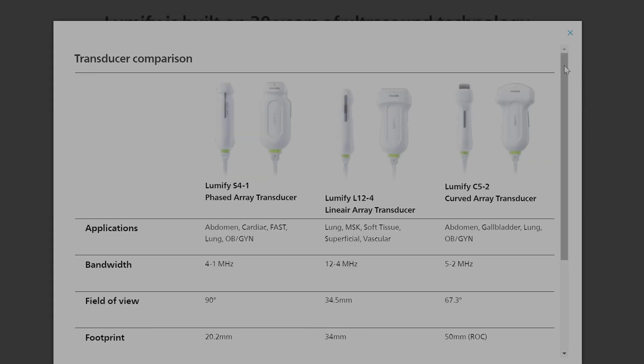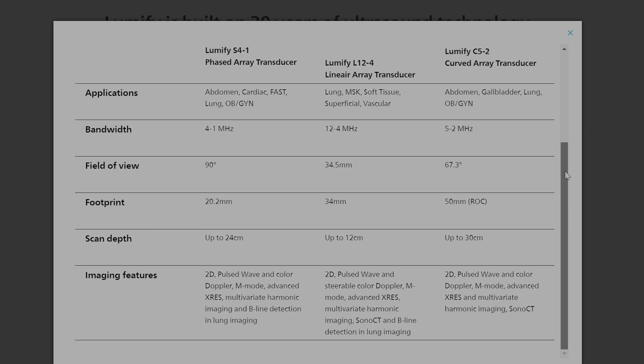The S4 has the smallest footprint, which is good for getting in those parasternal areas, and a pretty reasonable depth of 24 centimeters. The Linear 12 has a long and skinny footprint of 34 millimeters, providing high resolution with a short 12 centimeter depth. The C5 has a big footprint with deep imaging up to 30 centimeters, exactly what we're looking for in a body probe.